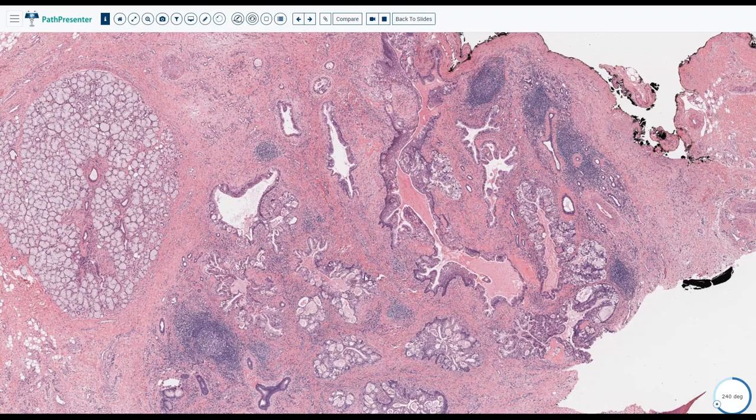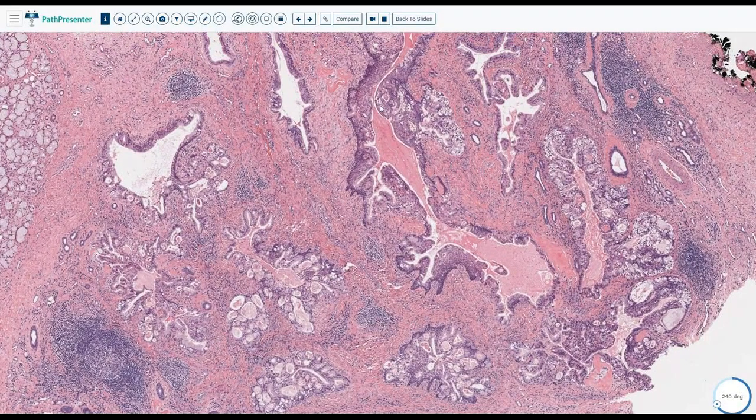Based on the cystic component, like what we have here. If the cystic component is more than 25%, that is a good cystic component, and it is low grade. This is the major component, but other features we use to upgrade the grade, and they are poor prognostic features that the surgeon will be looking for.